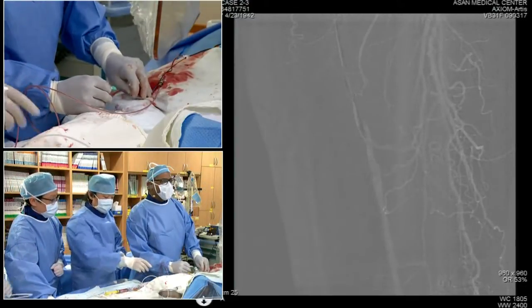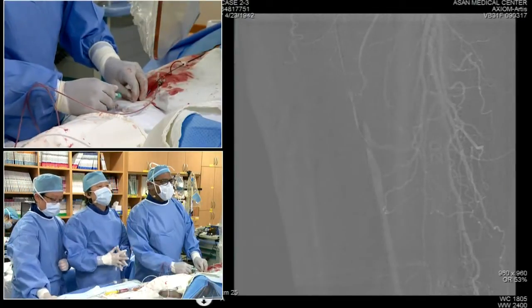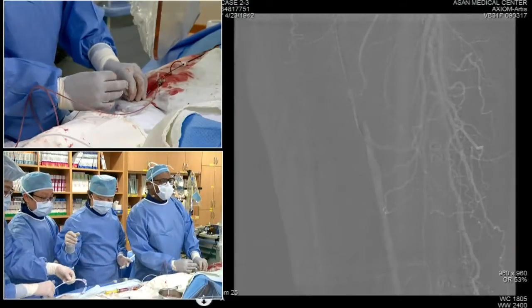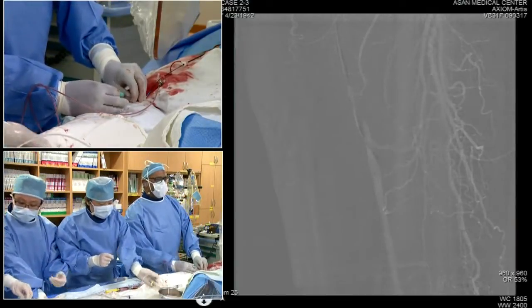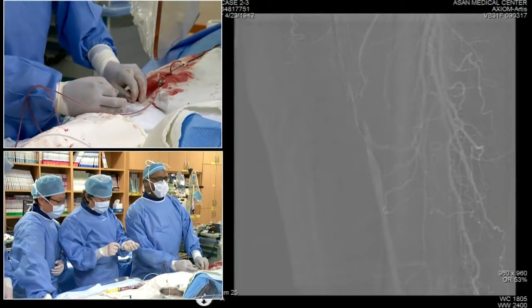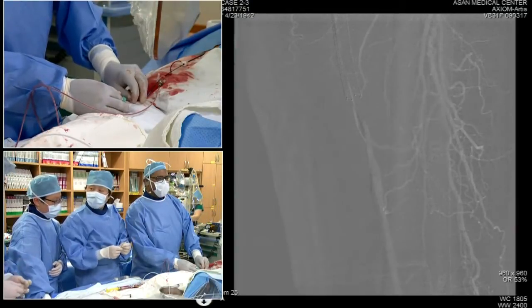Okay, I think they are ready in the other room, so I think we're going to switch over to the other room. Okay. And then we'll come back to join you later. Have you considered using an outback catheter here to try and re-enter? Yeah, actually, we're changing the wire to Astato 30 gram. Okay. So we're going to switch to the other lab, and then we'll come back and rejoin you later to see your progress, okay?